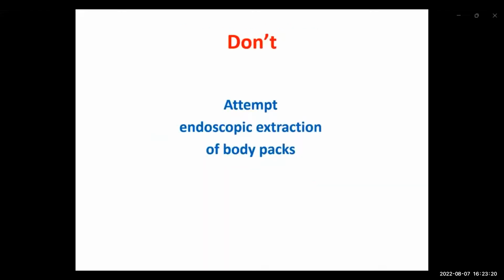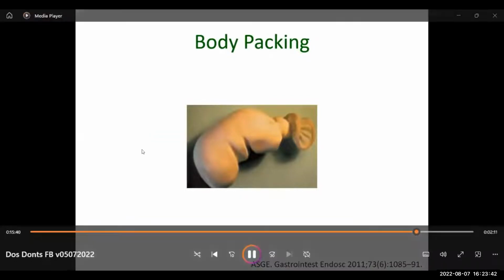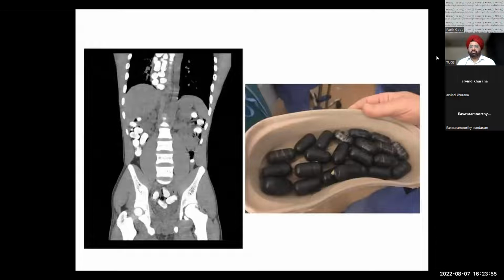Another don't. Don't attempt endoscopic extraction of body packs. Body packing consists of illicit drugs packed within latex condoms or balloons, then swallowed or inserted in the rectum or the vagina. Any endoscopic attempt to remove these foreign bodies is contraindicated because the outcome can be fatal in case of a rupture or leakage of the content. Surgery should be performed instead. Sometimes you must do don'ts.